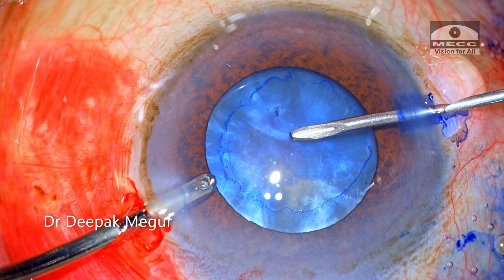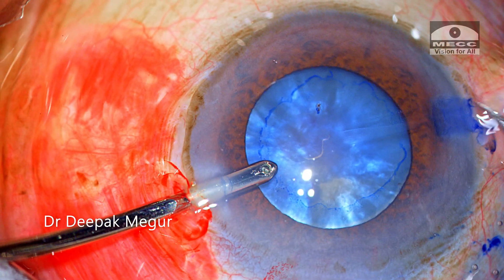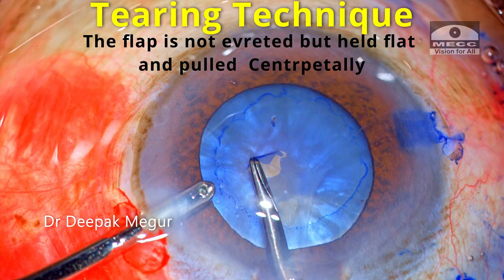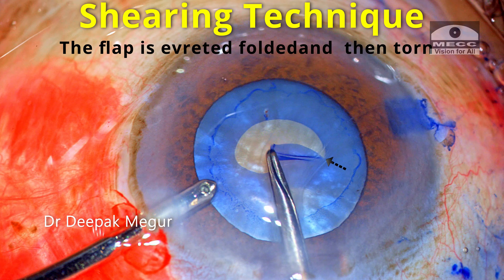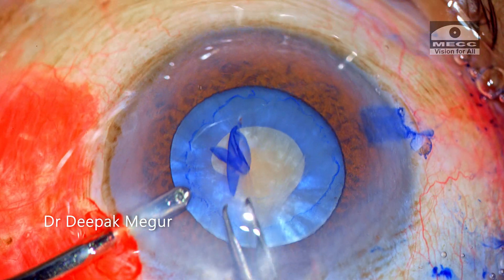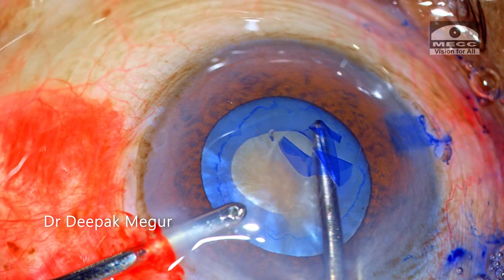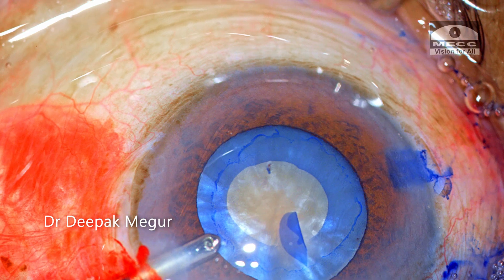I puncture the capsule with a 26-gauge cannula, and immediately upon puncture there is egress of some fluid, suggesting some form of spontaneous decompression occurring. I switch to forceps for the rhexis. I begin with the tearing technique and shift to the shearing technique once I am sure that the tear is under control. I must concentrate on the way the flap is tearing and shift immediately to the tearing technique if I get the slightest hint that the rhexis is not under control. The primary rhexis was very much under control and we have a nice 3 mm rhexis here.